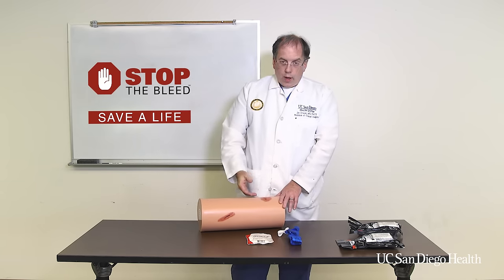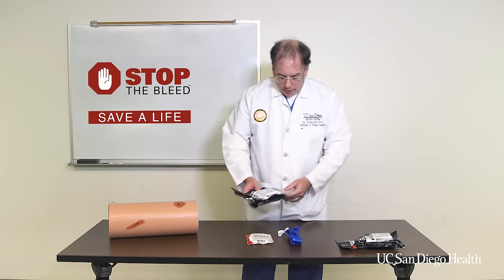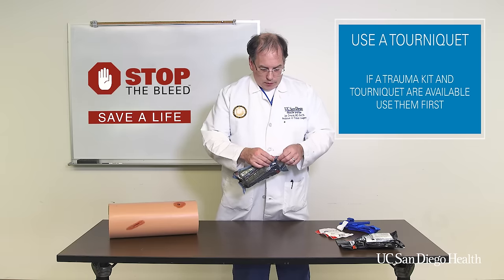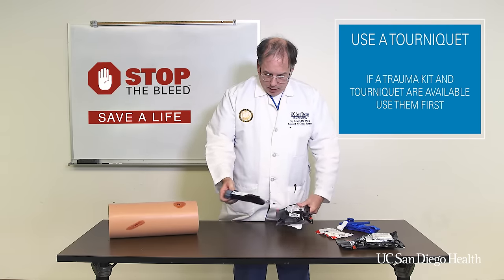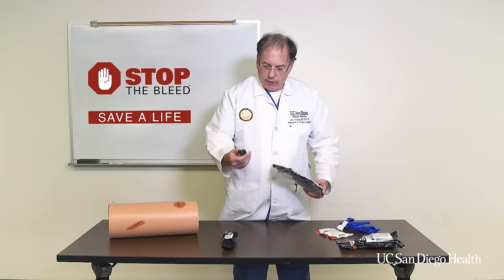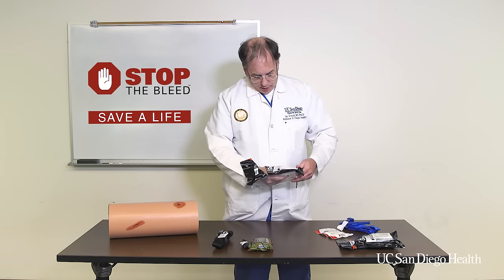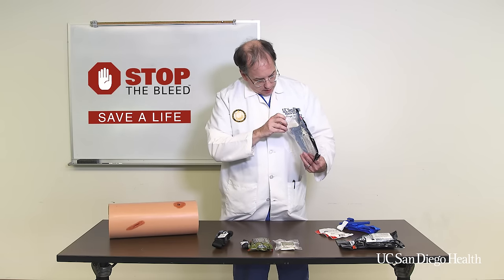Let's say you do have a trauma kit with you. This is an example of a trauma kit such as we issue during our Stop the Bleed course here at UC San Diego, and there are several things inside here that can help you with stopping the bleed. Opening this kit up, the first thing we'll find inside is a tourniquet. You're also going to find a set of heavy gloves, a compression dressing, a packing gauze, and a marker.